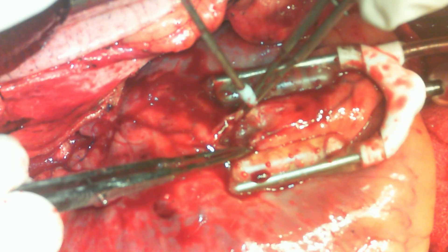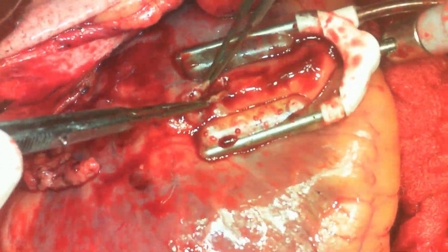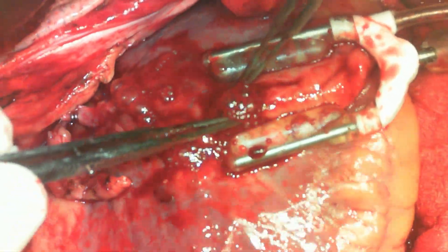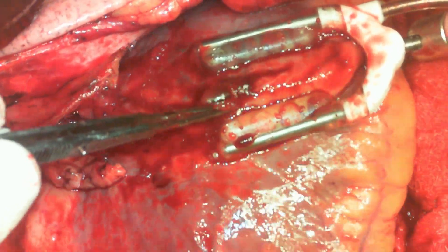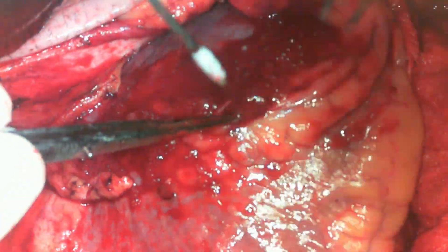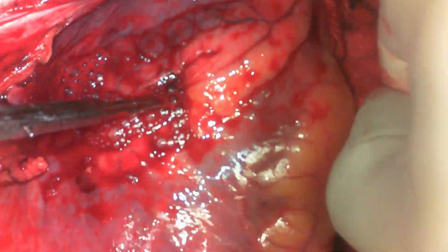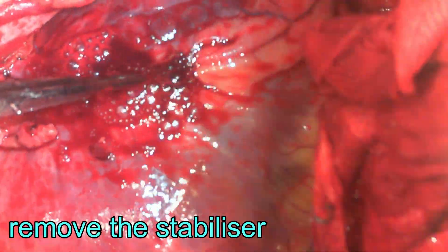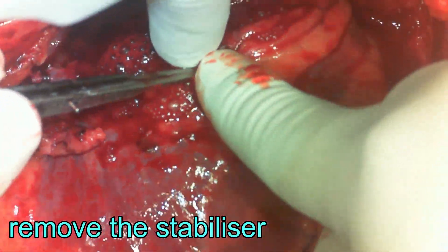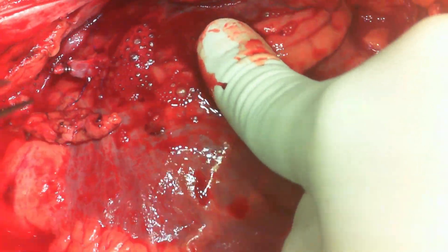This is a continuation video of the previous one. As the LAD was about to be opened, a gush of venous blood is seen coming from the right ventricular side, and it is instantly evident that this is an RV perforation. The first step is to remove the mechanical stabilizer or its parts, because if the heart beats against that part, the perforation will worsen.